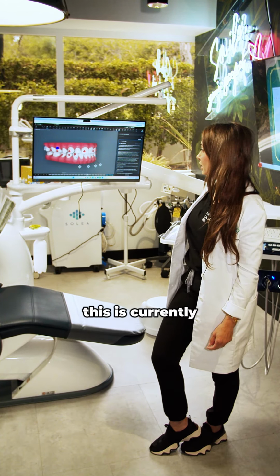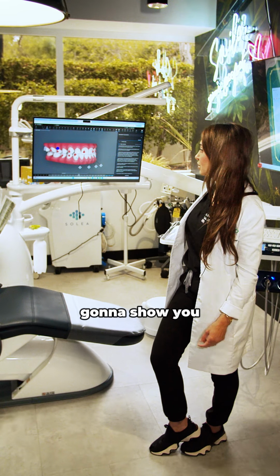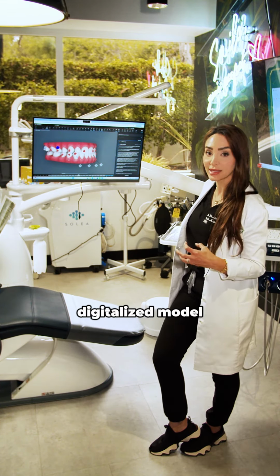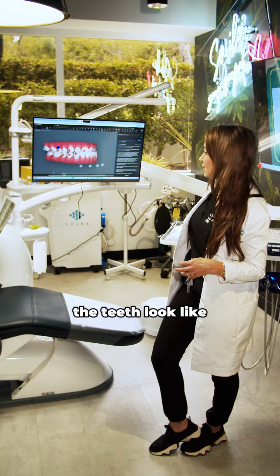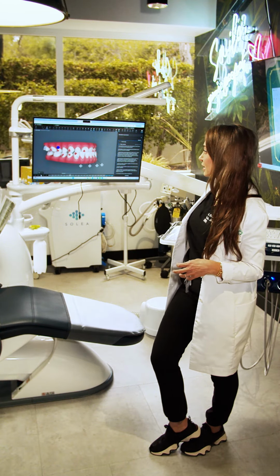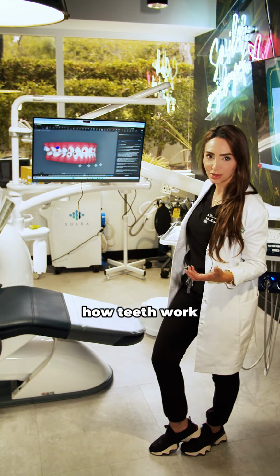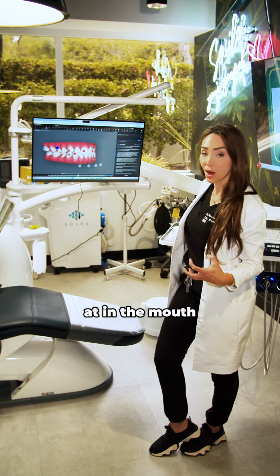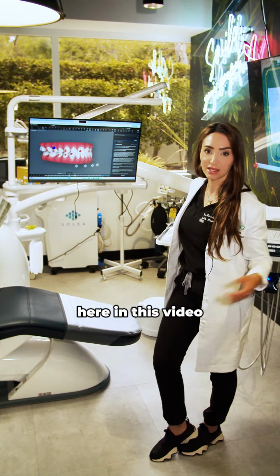This is currently where she's at. I'm actually gonna show you her picture of where she's at now. Since this is a digitalized model, you can kind of see that the teeth look like they're disappearing behind the backs. Now, that's not how teeth work. They're not ghosts. They don't disappear. What that looks like in the mouth is what you're gonna see here in this video.